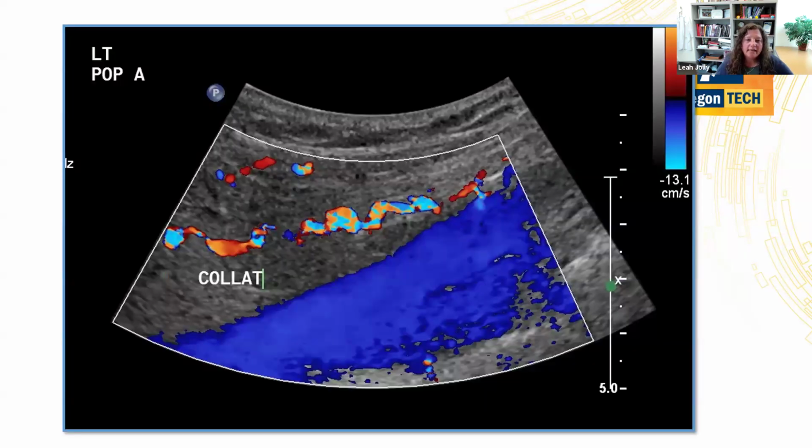So here's just a practice example, and this is a popliteal artery. So we're behind the knee, and they're using the curvilinear transducer, but just so they can show this long segment collateral vessel. So this is a tiny little vessel that basically what's probably happening here is that the actual popliteal artery is occluded, and this collateral is providing flow around that.